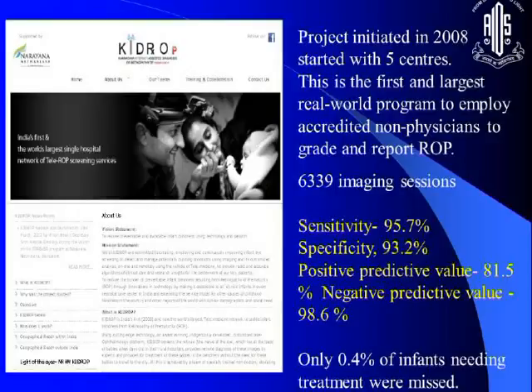Now Dr. Anand Vinekar, who spent a lot of time with us at PGI for 6 years, has become synonymous with telescreening anywhere in the world. I think he has the largest database at this time. He was the first to try taking one machine to various places, even in rural areas, and he has reported sensitivity and specificity of something like 95 and 93%. So this is a great tool.